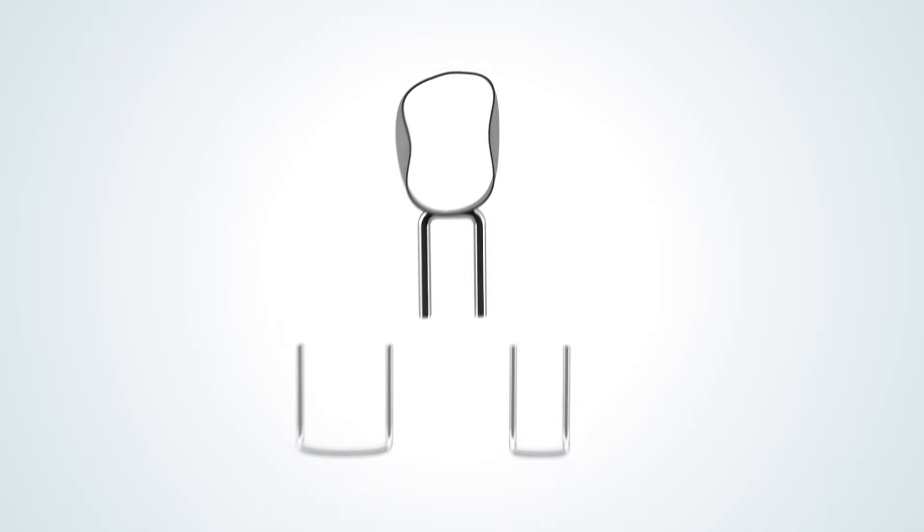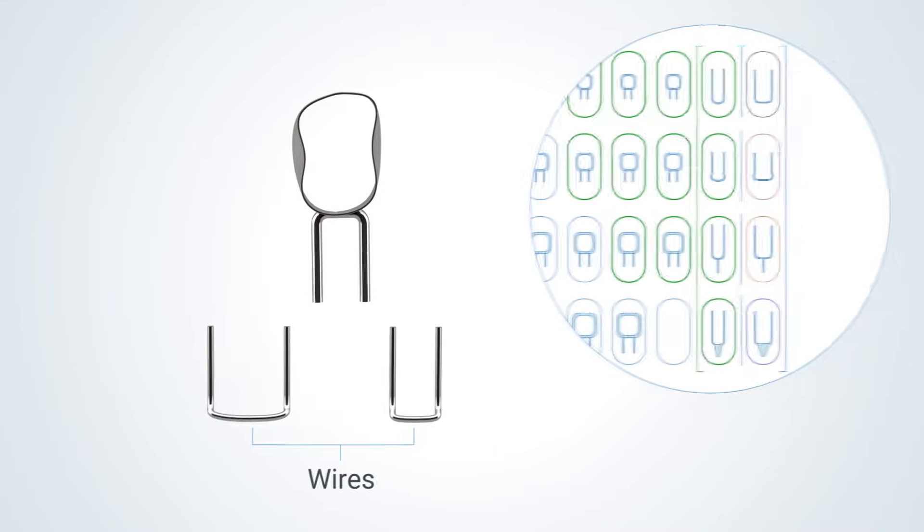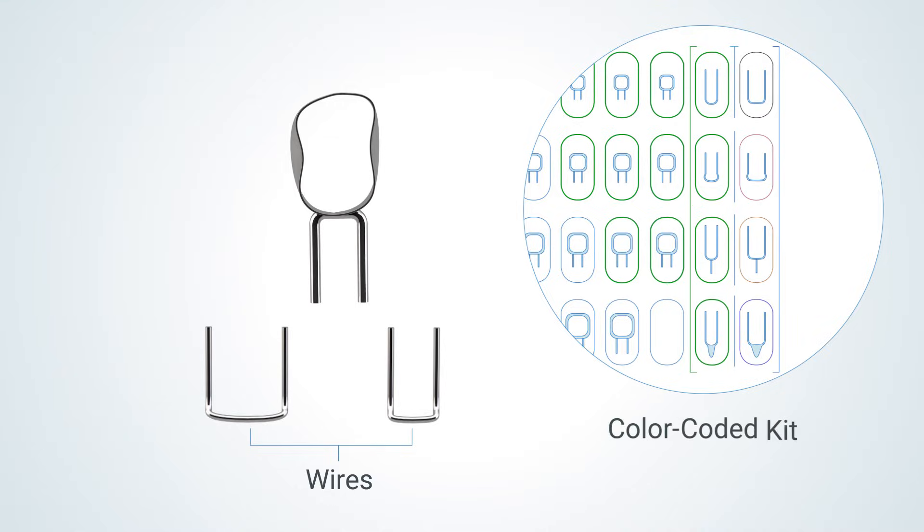Next, select a wire size and type. Wire widths are narrow or wide to match the smaller and larger band or crown size ranges respectively. Band and crown sizes in the kit are color-coded according to the matching wire.